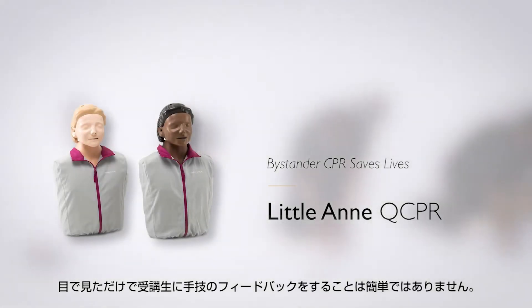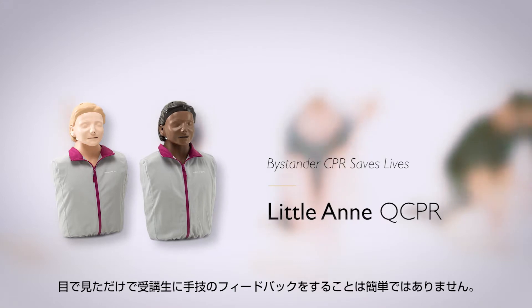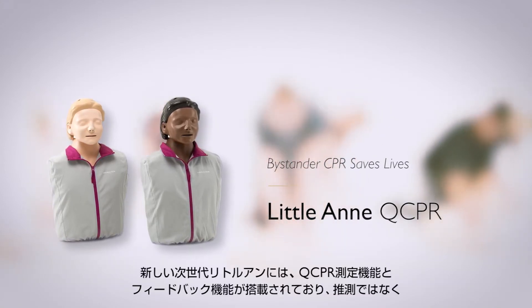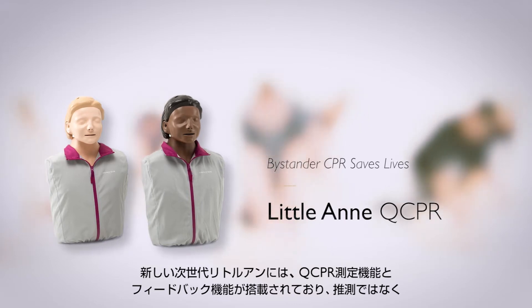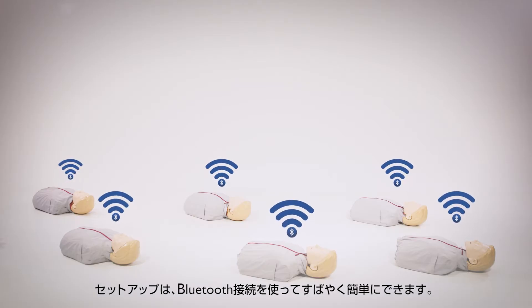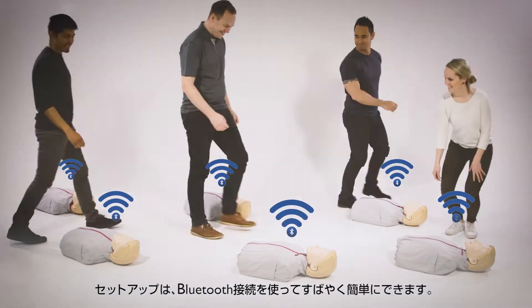Providing feedback based on watching your students perform CPR can be challenging. The next generation of Little Ann includes QCPR measurement and feedback technology that takes the guesswork out of instruction. Using a Bluetooth connection, it's quick and easy to set up.